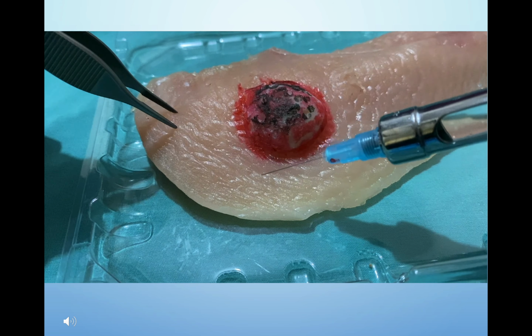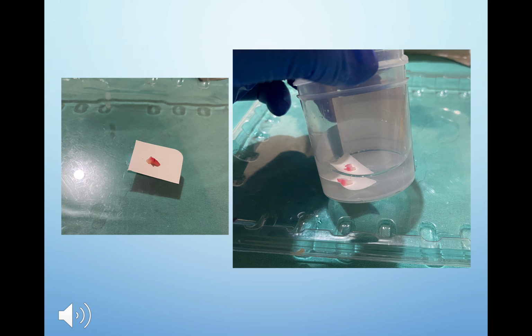If you have a small specimen, it can be placed on a rigid piece of paper, for example, the packaging of the suture material, before placing it into the formalin solution in the specimen bottle. This could prevent the tissue from rolling around itself and collapsing, which will make it more difficult for the pathologist to orient and interpret the specimen later.